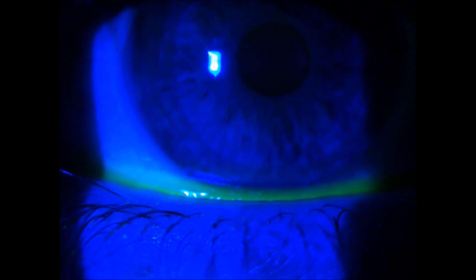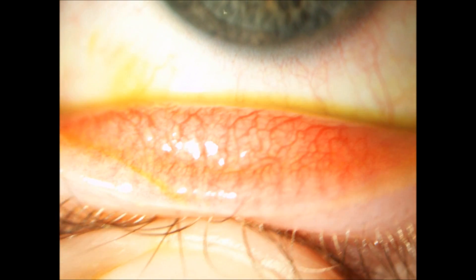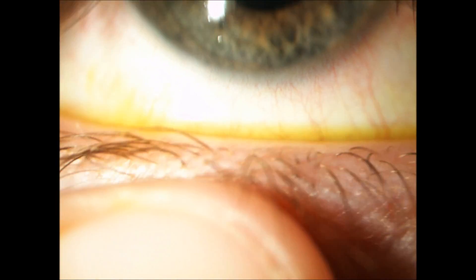We'll get the patient just to look down after we've recorded it — that's fine, just assist them with your thumb. Then we'll assess the inferior tarsal conjunctiva. Bring your thumb in and get them to look up, just pinch a little bit and bring it out. You should be able to see some of the staining there — not too much, very slight. Now we'll flip it over to white light and then we can assess the lid redness. You can see there — it's not too inflamed. We'll grade that as well just using the grading scale.